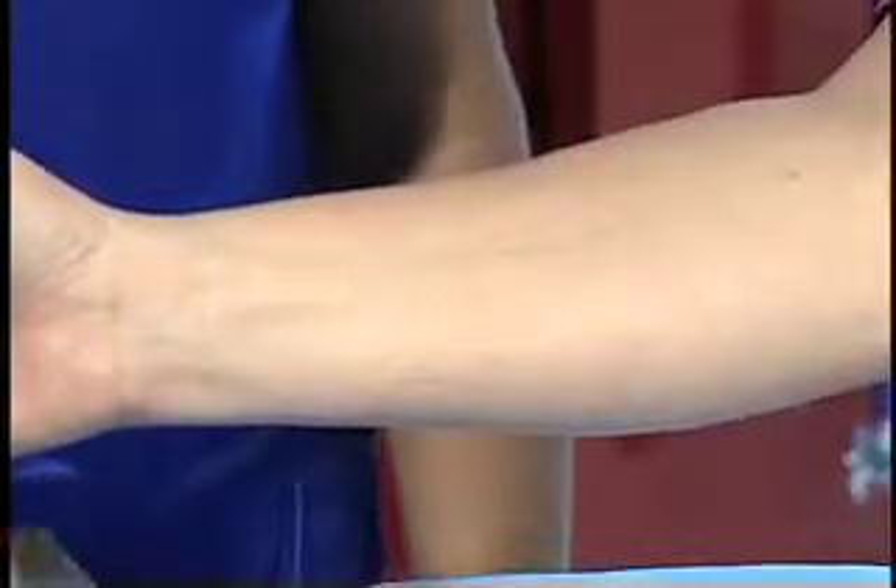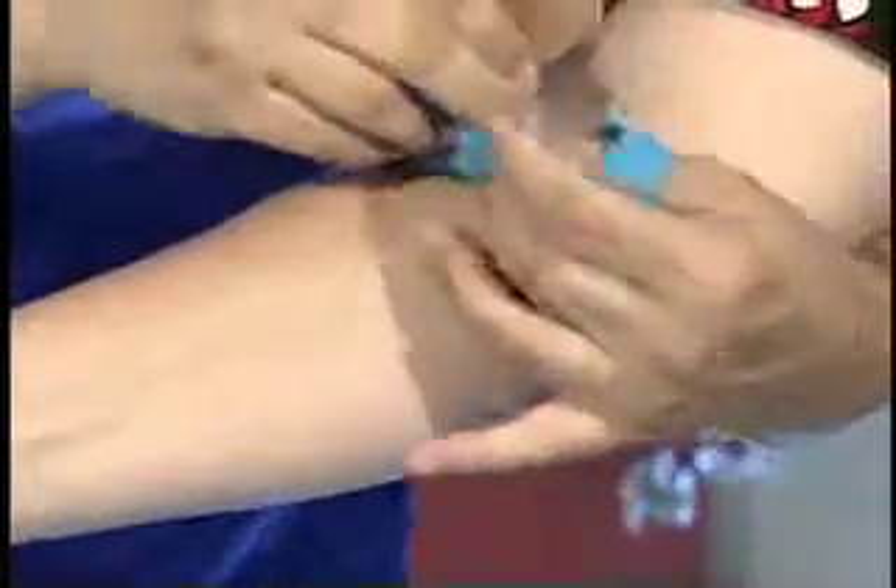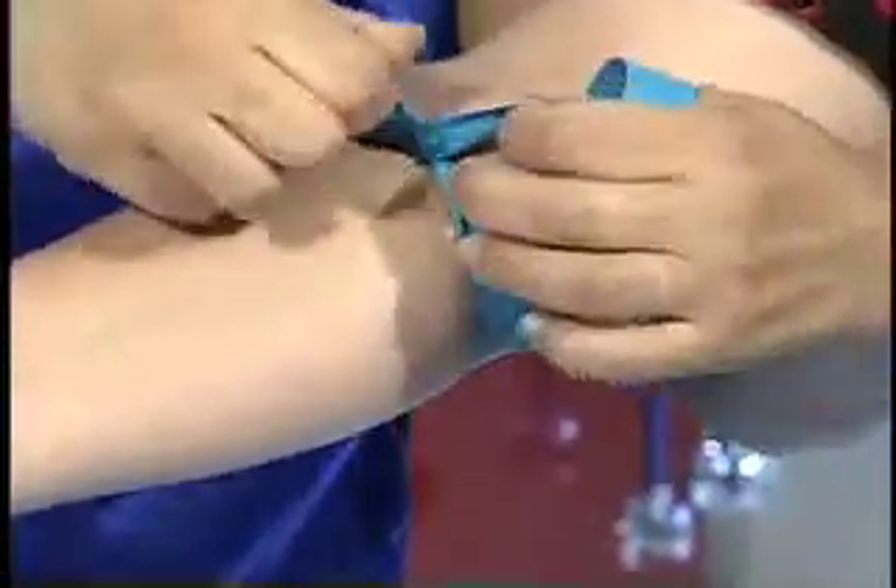The tourniquet is used to distend the vein, making it easier to see, feel, and access. Apply the tourniquet five to six inches above the venipuncture site by encircling the arm with the tourniquet, crossing one end over the other, and tucking an end snugly underneath, making sure that the loose ends do not obstruct the venipuncture site.